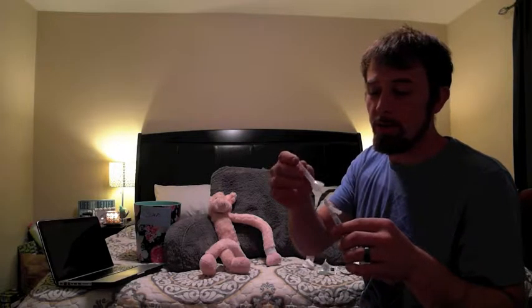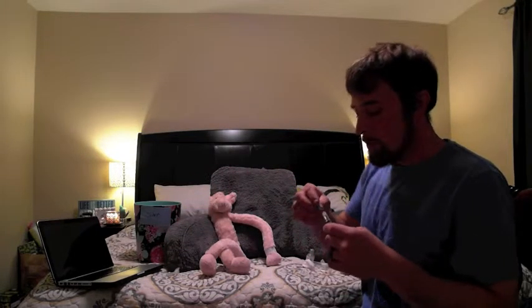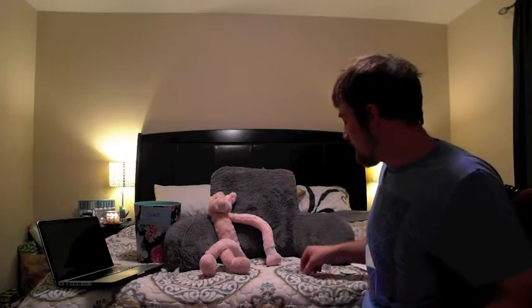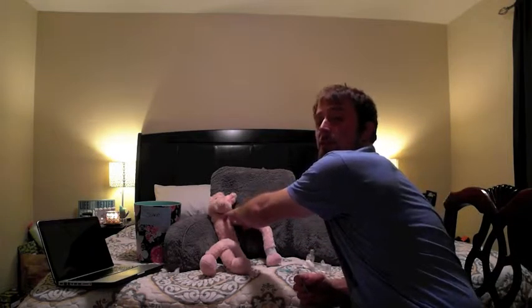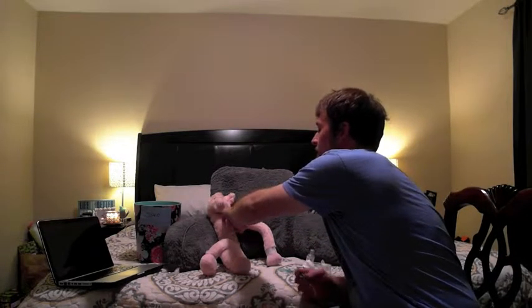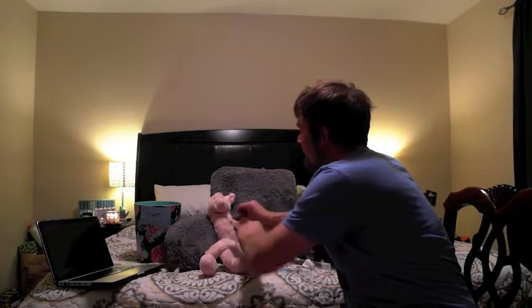You would not want to normally recap a needle, but since I'm going to be reusing this for other demonstrations, I'm going to recap it instead of sliding the safety up. Then I'm going to remove it, toss it in the sharps container, and attach my new needle with the cap still on, set it on the counter. Then I'm going to find the acromion process on my patient, go 3 fingers down, unwrap my alcohol prep pad, clean the area in a circle from the inside out.